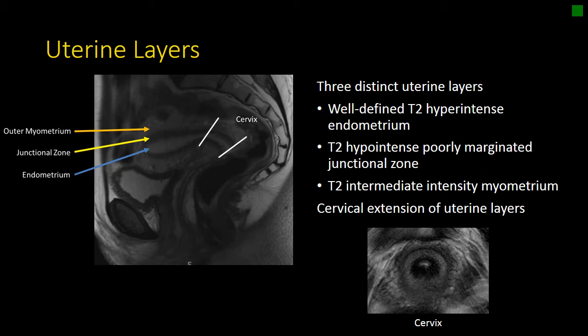When we think about the uterus, you can think about it having three basic layers. The inner endometrium on CT is often low in attenuation and resembles fluid. On MRI, it also resembles fluid and is T2 bright. The junctional zone is the middle layer. On CT, it is often indistinguishable from the myometrium unless there is an enhancement pattern that makes the junctional zone distinguishable from the myometrium, which does occur with relative frequency.